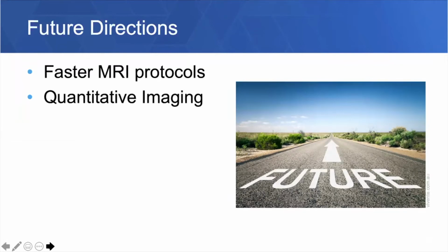That's one of the main limitations of MRI. The exams are long. Kids will often need sedation. Well, more and more, we're starting to do these fast 5-minute protocols that may allow you to do an MRI in the ER, right? People are doing it for appendicitis. Even in very young kids.